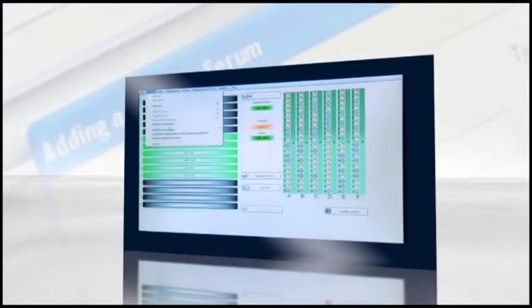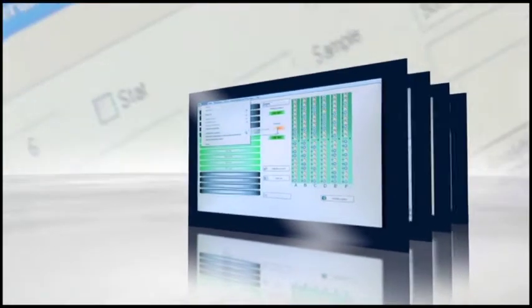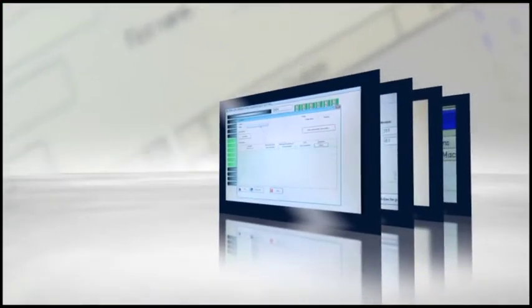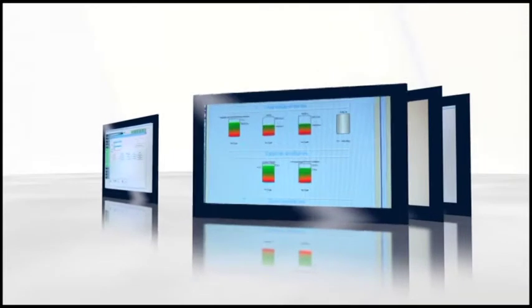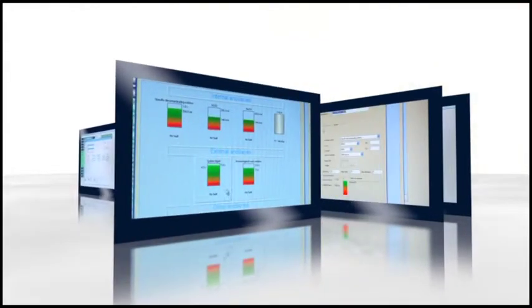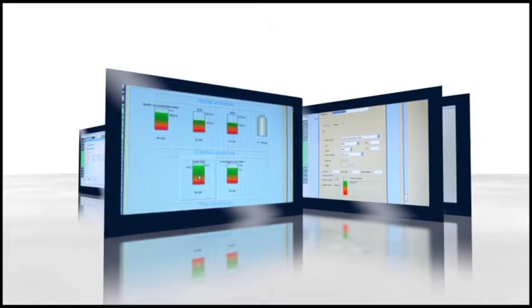Simply select the sample and the analytes you wish to assay, start the system, and the software will display the real-time status of all assays. Reagent and consumable management is monitored by the software. Remaining reagent volumes and number of tests achievable are shown using a simple graphical display.